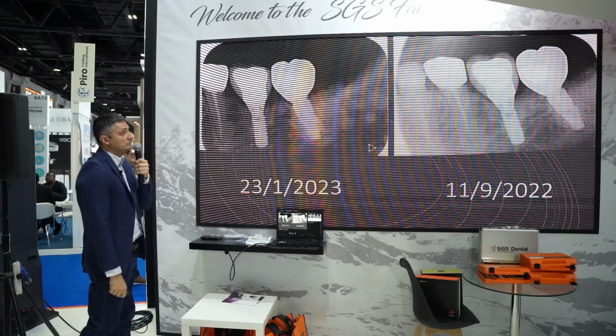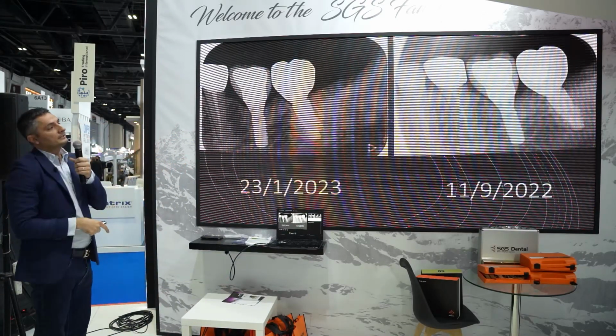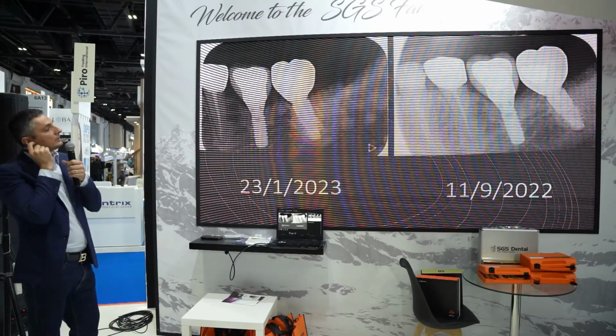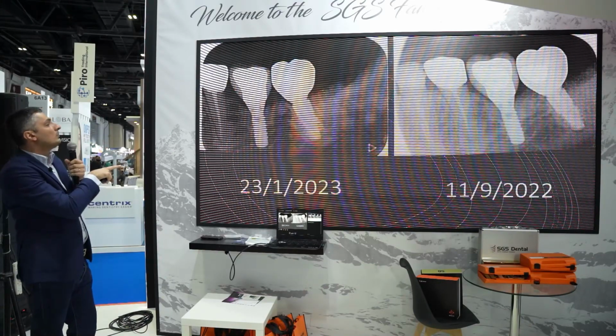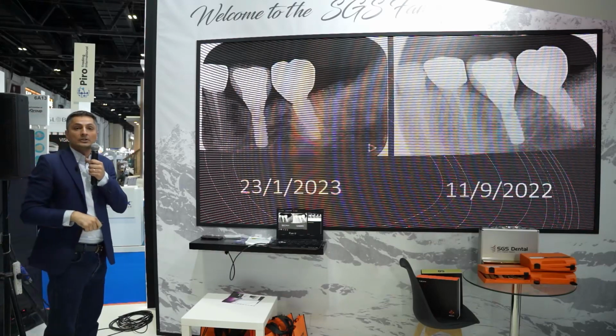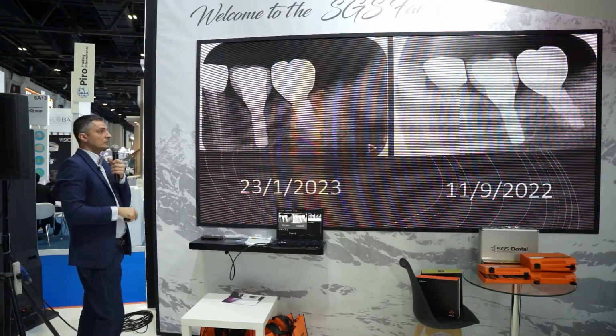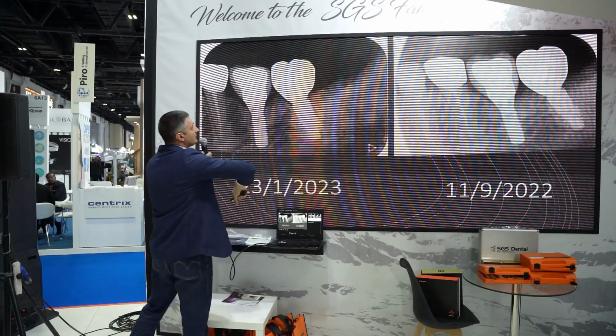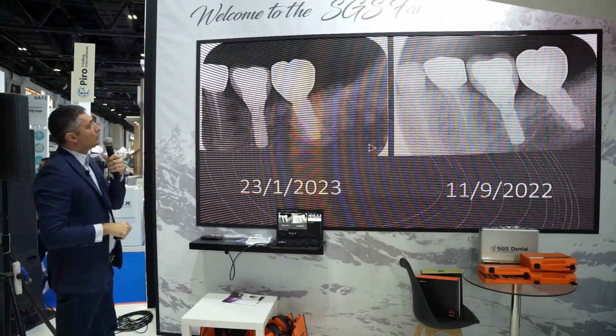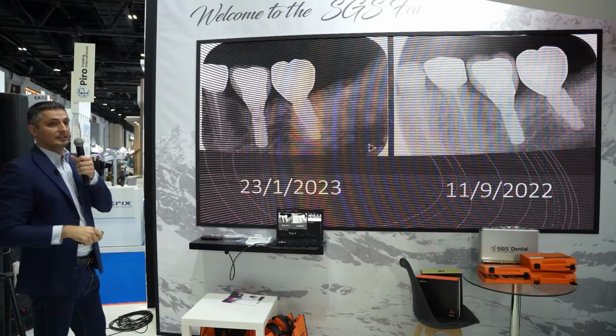So this is the x-ray when we load the implant. Everything is okay. There is a bone maturation. And this one is after a few months. Till now, all is getting well. All is okay. Here, there is a big difference. There is bone healing on this side and more bone maturation from the grafted socket.